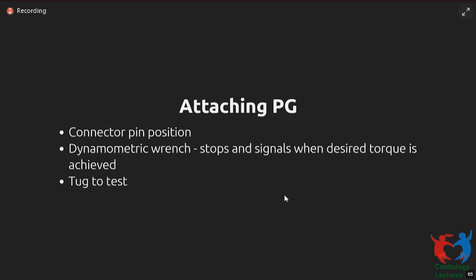But if there is confusion, you can again retest with the pacing system testing with the PSA to see which chamber you're pacing and then test. Or you have the lead boxes outside, so double check the serial number. The serial numbers are always marked on the proximal part of the lead. Double check the serial number and then screw it in. So again, this is something that happens once in a while, that leads are connected wrong. So it's a bad thing to have to go back into a patient just to correct your misconnections.